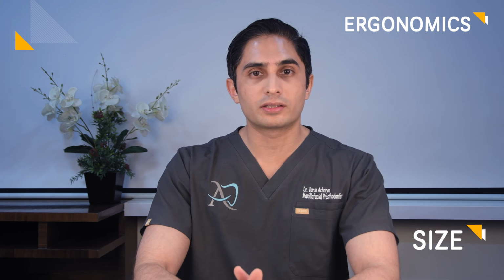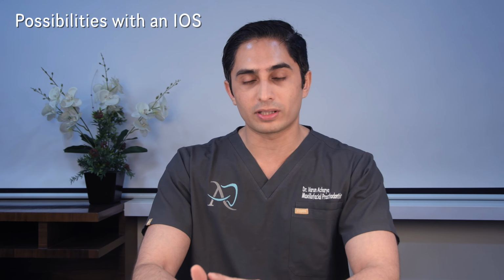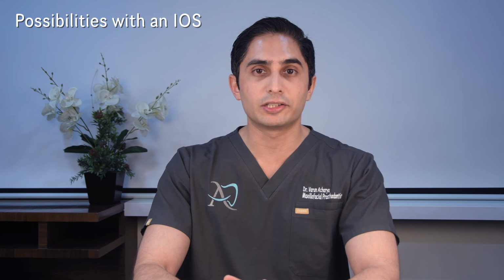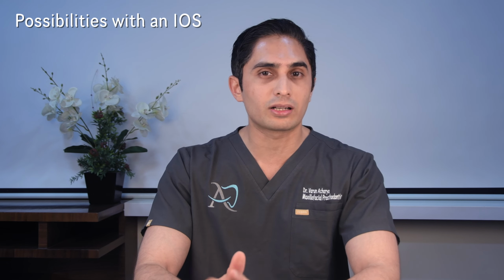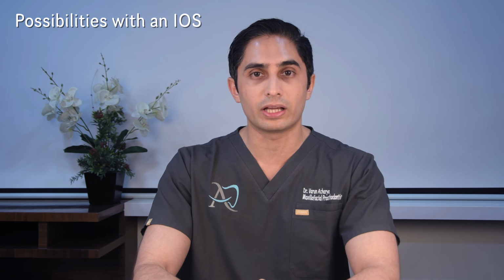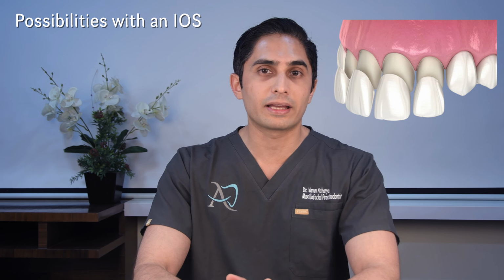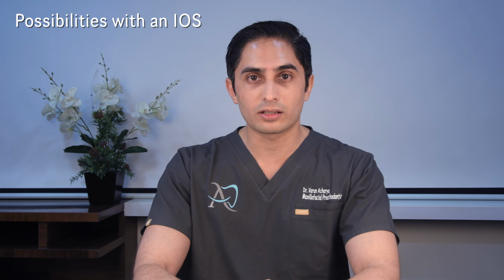Now, before we get into the size and the ergonomics and the cost and the software and all of that stuff, let's talk about what you can and cannot reliably do with the scanner. What you can do is single tooth dentistry. So it's a single crown. For sure, you're going to be able to capture a very nice digital impression and get a very nice result with an intraoral scanner. And I would say this regardless of the brand. You're most likely going to be fine with any of them. For veneers as well, veneers are quite simple, and you can definitely get a good scan of your veneer preps with an intraoral scanner regardless of the brand.